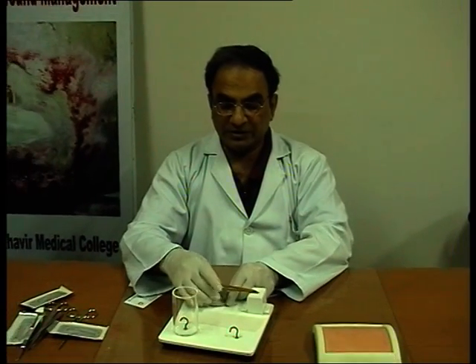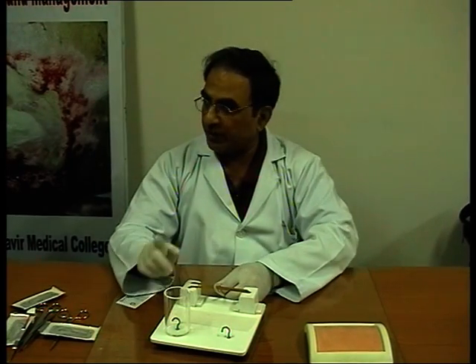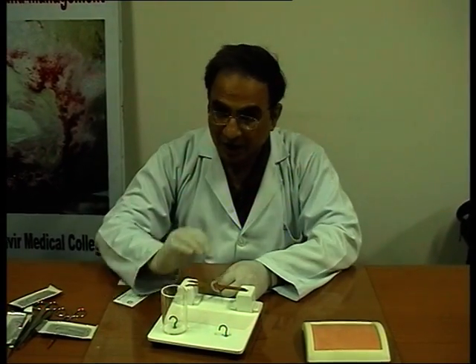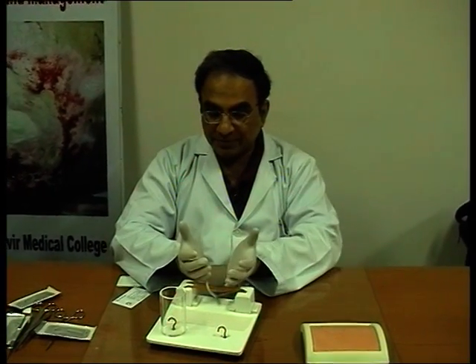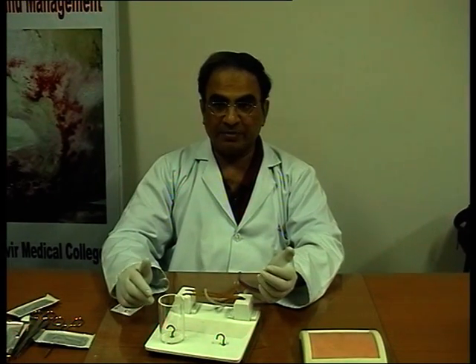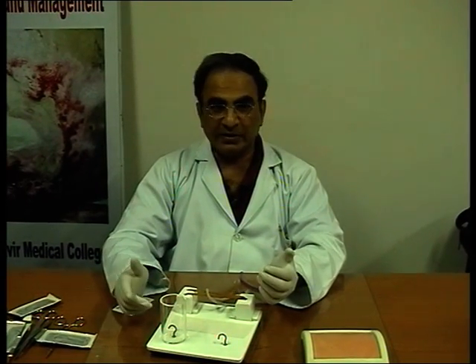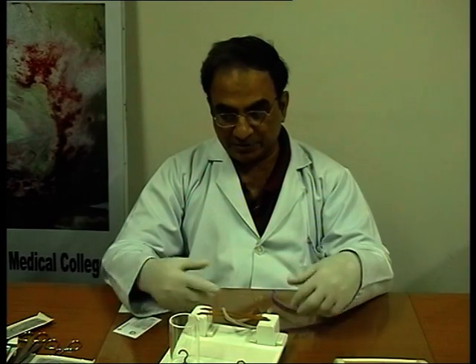The third thing is a knot called slip knot. It's a situation where you deliberately want the knot to slip down. When does it happen? If you're dealing with bleeders in the depth. Don't think, I may do radiology later on in my life, so I may not deal with bleeders anyway. Every basic doctor has to learn about suturing and knotting. It's not surgical teaching that I'm giving. It's supposed to be learned by everybody.